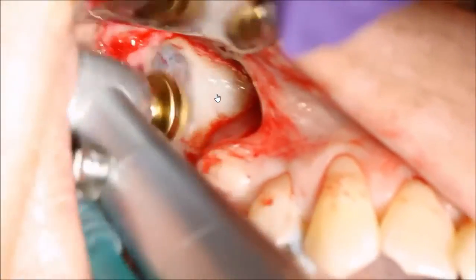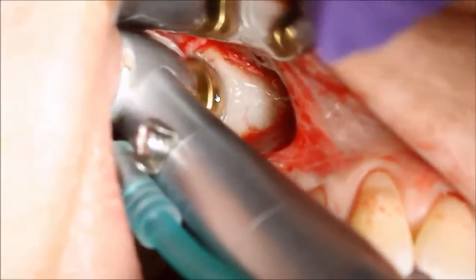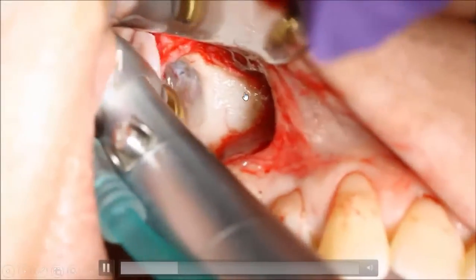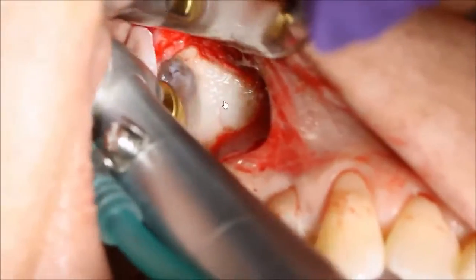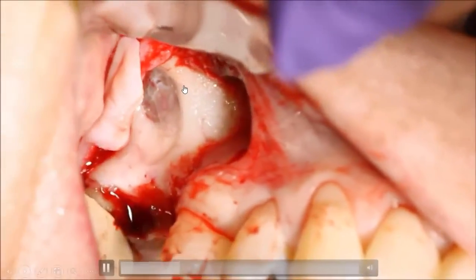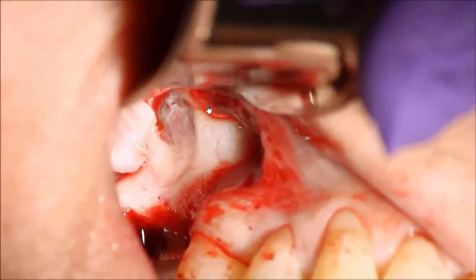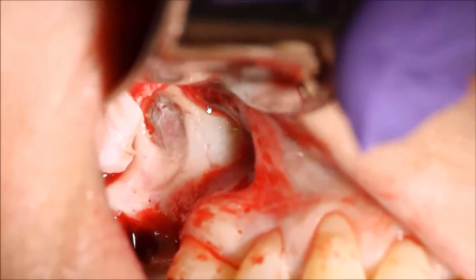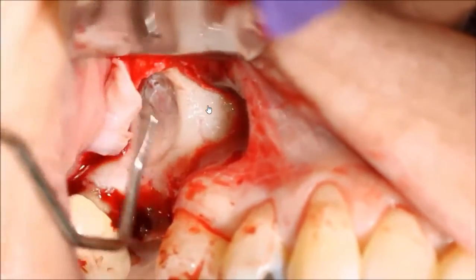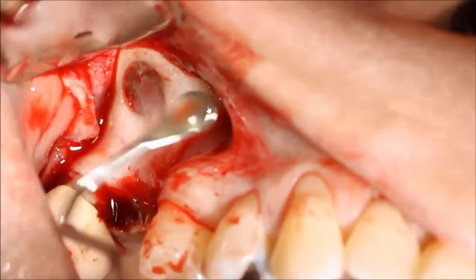وفينا نعمل extension للويندو by this bur. هون مثل ما ملاحظين I'm extending my window. So actually I don't like to have a very large window and not also a small window. يعني لازم يكون متوسط، diameter الويندو يكون حوالي 7 by 7 millimeter.